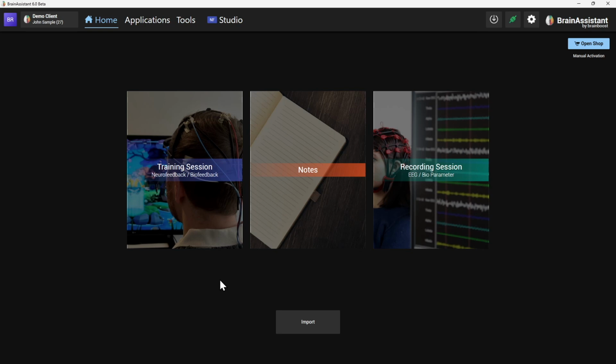Linda, can I create a map from a qEEG EDF plus file I already have so I can compare current and past? This is the question about the Nexus. So nice, Linda, thank you. Yes, so when you have an EDF file, EDF means this is the file format for EEGs.